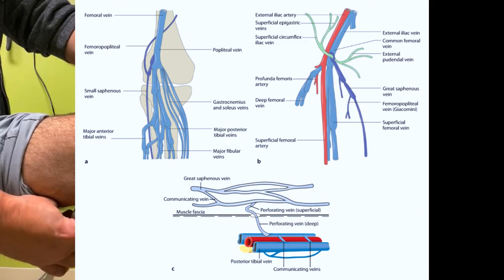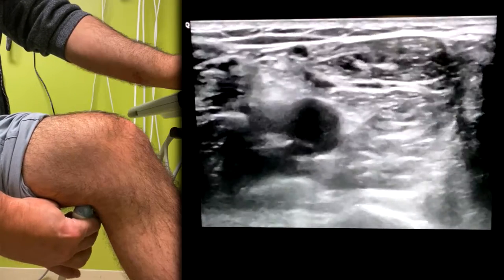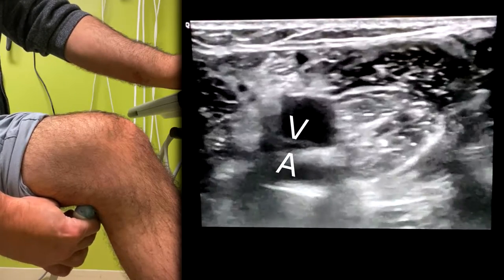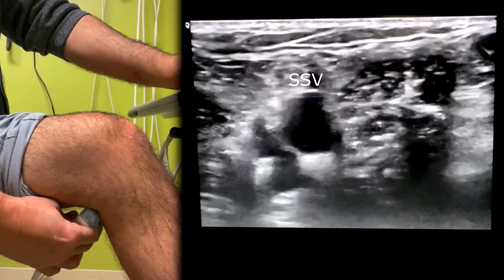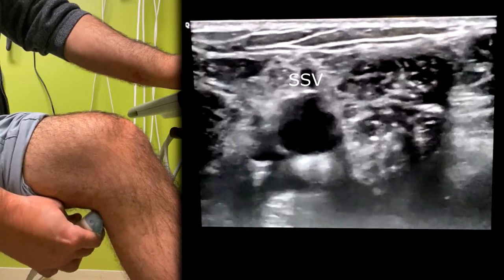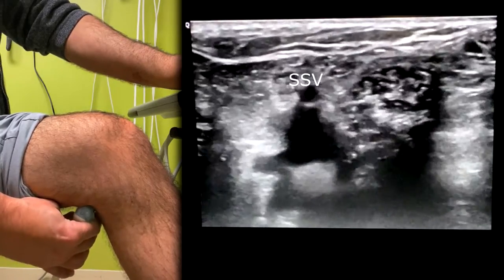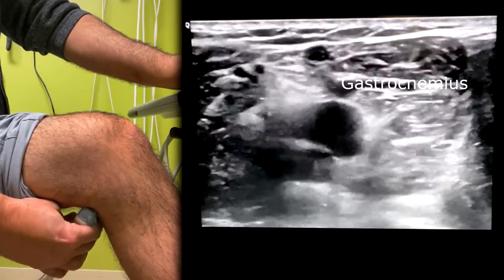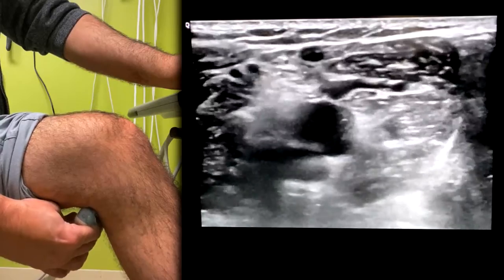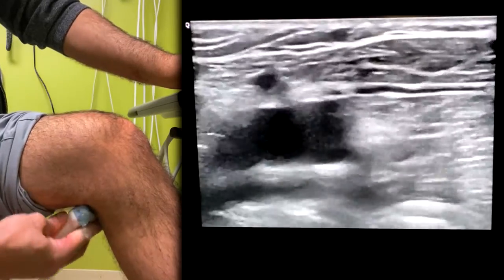So there you see the popliteal vein and the artery, and you see the beginning of the lesser saphenous or small saphenous vein, and you see it going superficially, and then also the gastrocnemius vein right there.